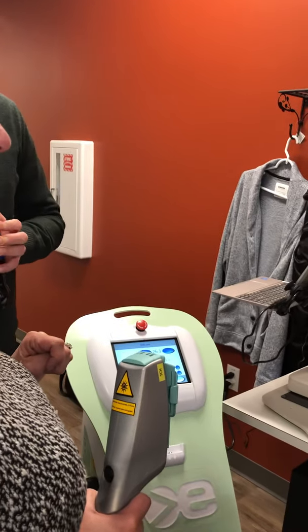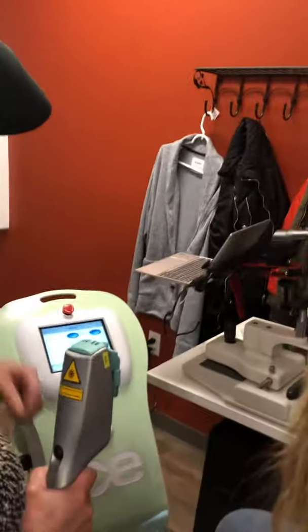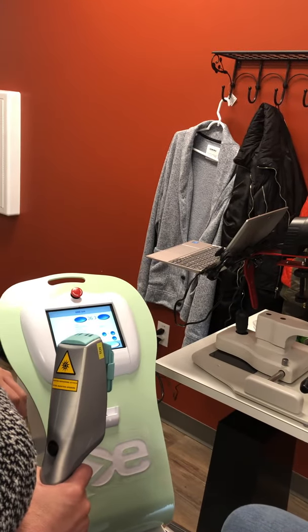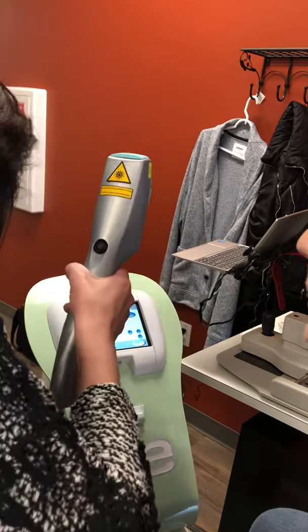So do you charge per how many times you hit it? No. Do I have to sign a waiver for this or something? Before I leave, I'm going to give you a patient consent form. Because, you know, the indications and contraindications. Stay out of the sun, don't be in the sun before. Cover yourself. So the patient understands. Stay away from the eyebrows and lashes.